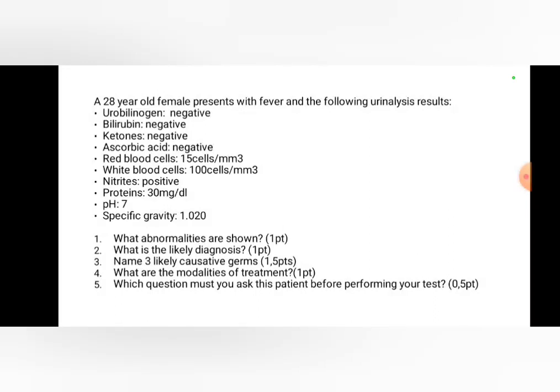Is it clear? They are going to be dysmorphic. But in the case of a urologic hematuria, the red blood cells are going to be the normal biconcave shape. Is it clear?